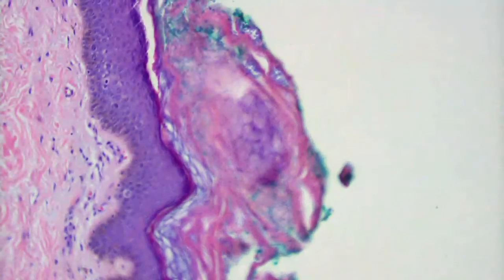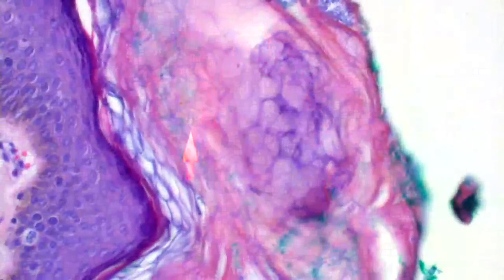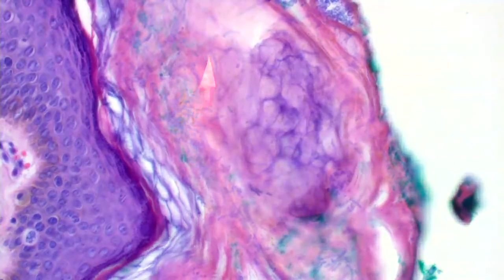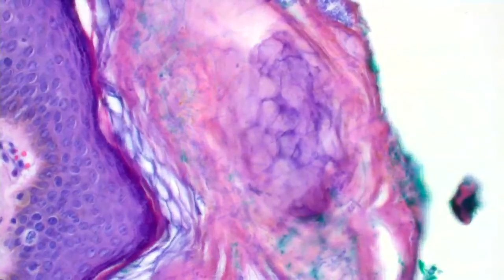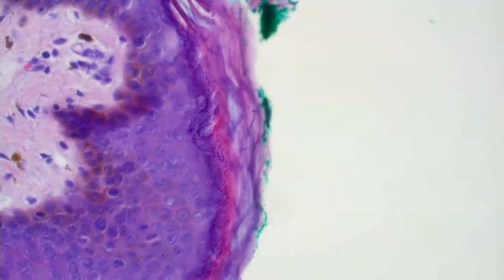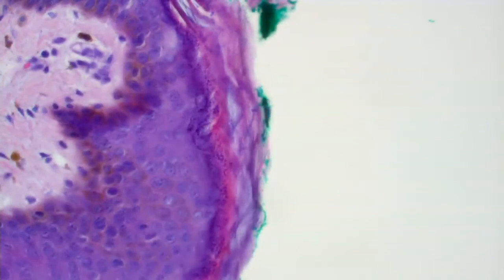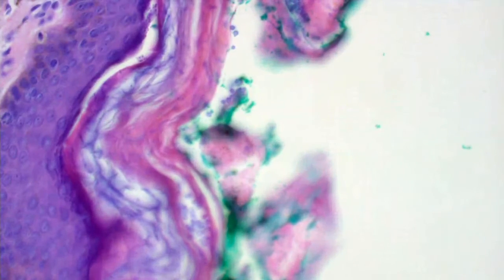What about the organisms? What's in the differential diagnosis of the organisms? So let's say you recognize these are here. If you're going to be taking a board exam, what kind of things are they going to put on the exam to try to fool you? Well, if you just see the hyphae, you don't see the yeast, you may think of a dermatophyte. Yeah, dermatophytosis might be one. What else might you think about? Candida. What about erythrasma? They might put that on there too. Some people are going to see that in the cornified layer and think those are bacteria. They're not used to looking at things under the microscope.